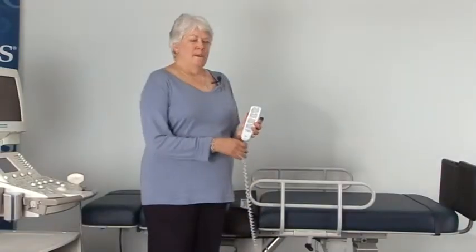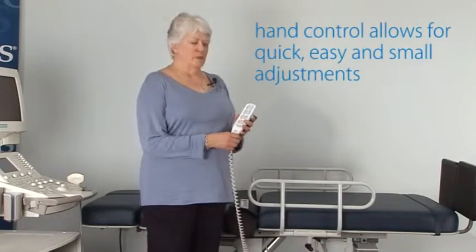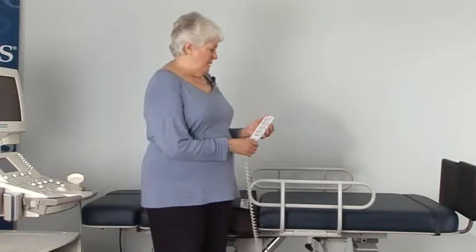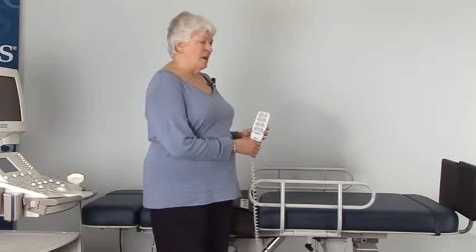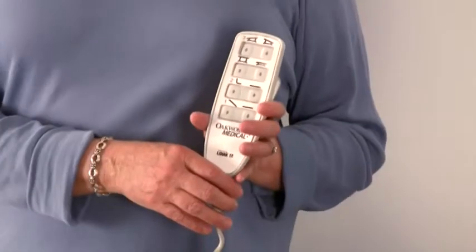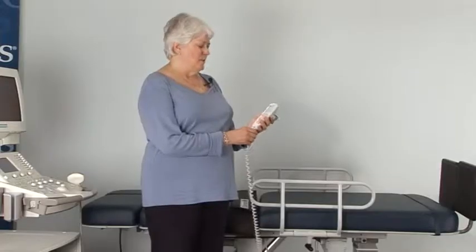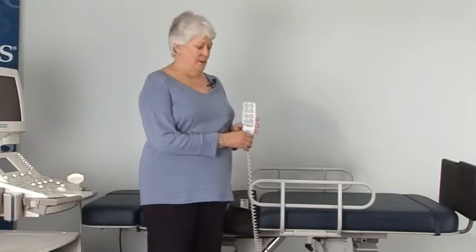All ergonomic tables should be electrically controlled. This allows for quick, easy, and small adjustments while you're doing your exams. These tables all come with a hand control that controls the Trendelenburg, Reverse Trendelenburg, Fowler, Height, and other special features unique to certain exam tables.